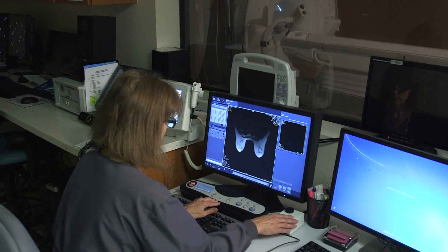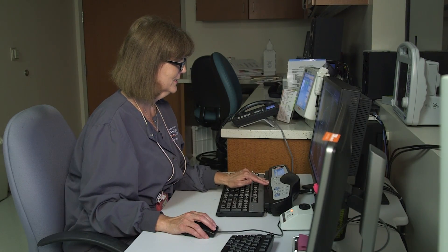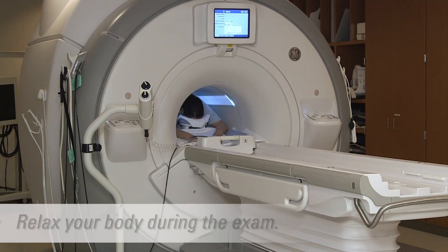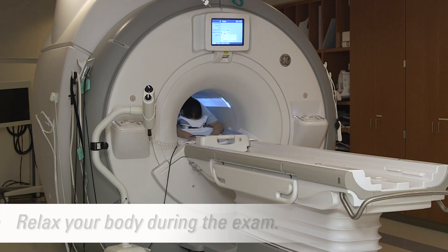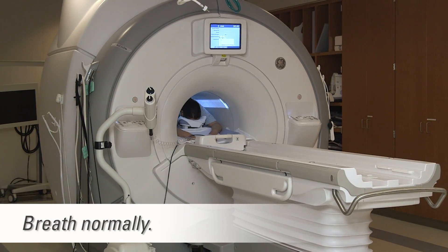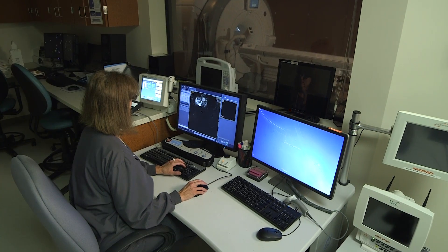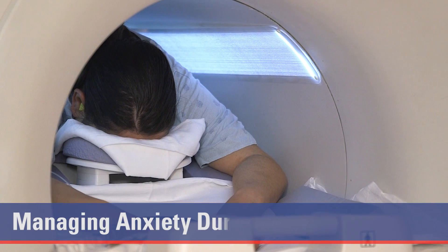When you focus on remaining still, you may tense up. Tensing up will cause your muscles to twitch and this will cause your breast tissue to move. This causes images to be blurry. It is important to get a good image because it will help your doctor make a proper diagnosis. Breathing normally is essential. Getting a usable scan the first time means additional scans will not be needed. Some patients need help to relax during an MRI.